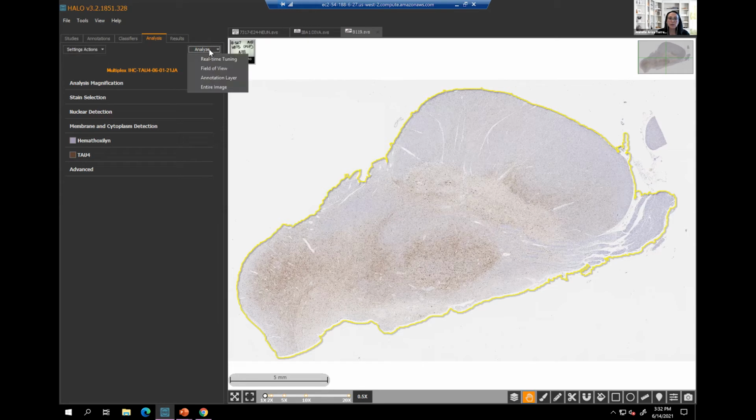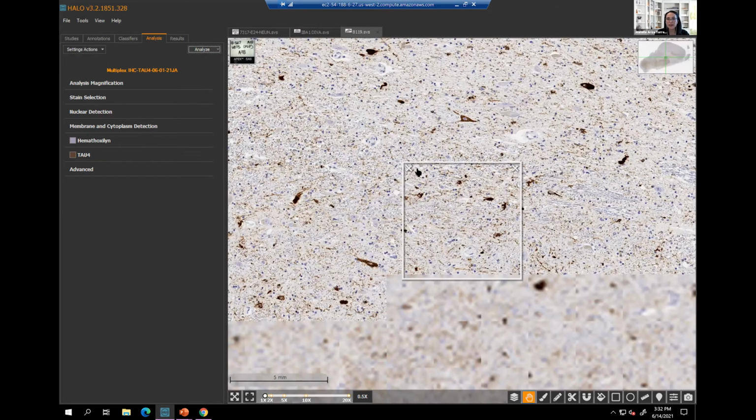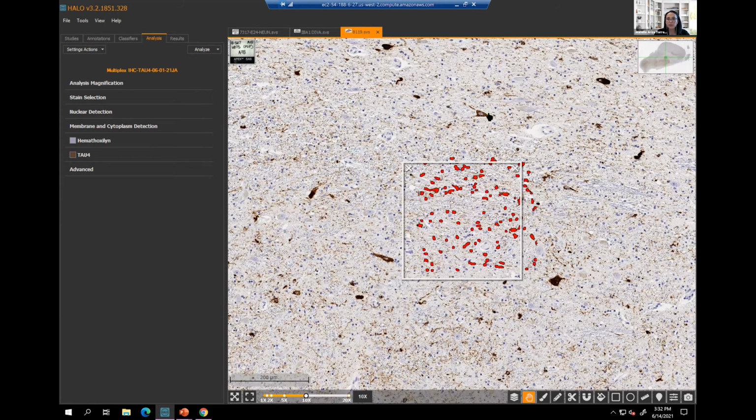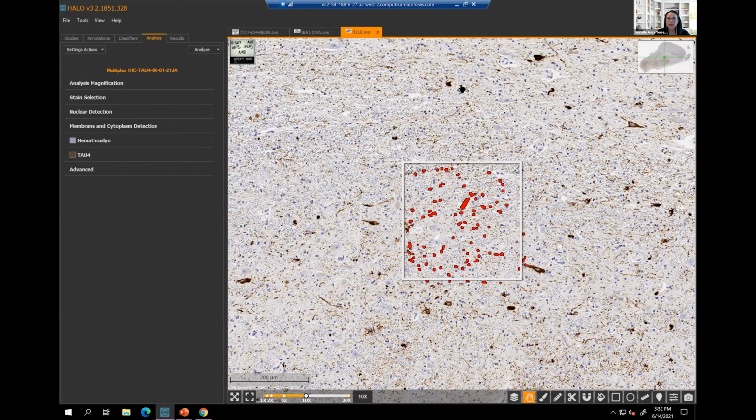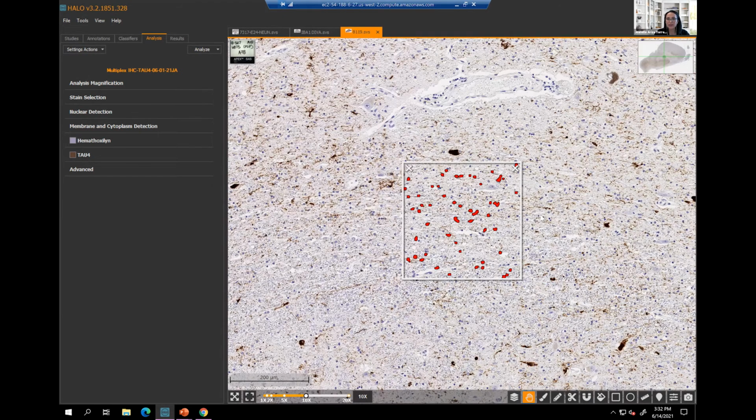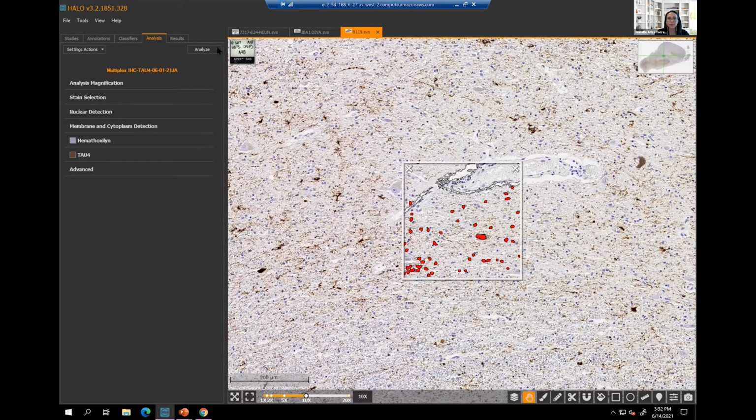So when you are doing the analysis, you can start having a real time tuning of that algorithm for you. So you can make sure that you are doing the right modifications of the algorithm.